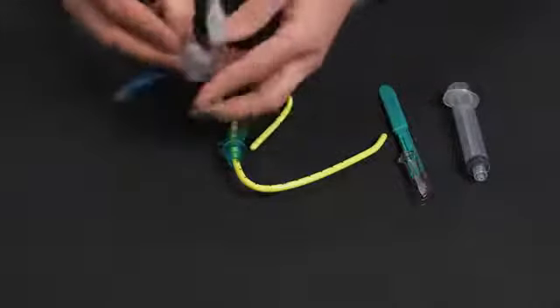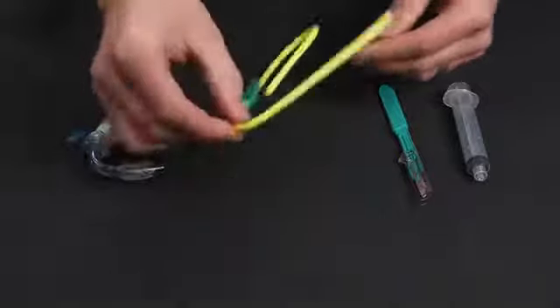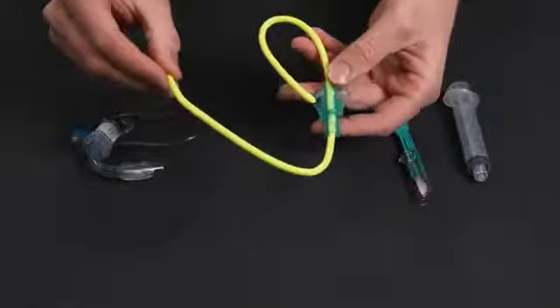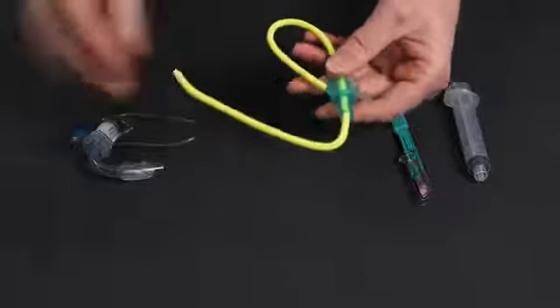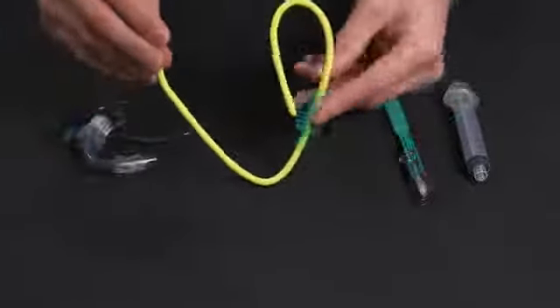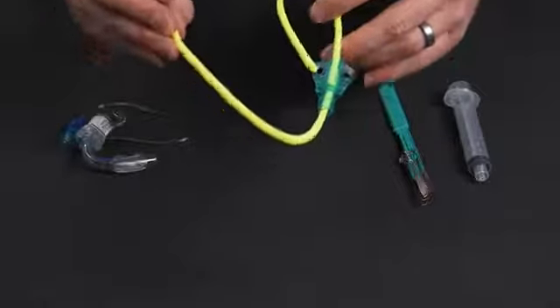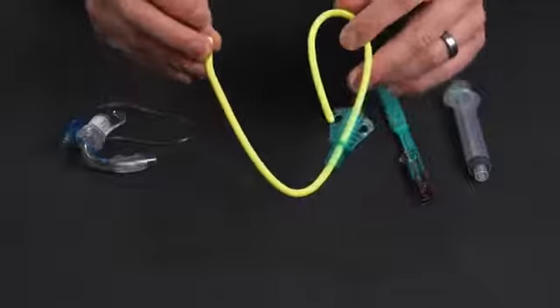Now, the second thing you're going to need is going to be some kind of introducer. Now, I like to use bougies. That's what this is. Now, this one is a specialized one that actually comes with this tube preloaded on it from North American Rescue. This just allows you to get this in place and secure the tube and not lose your spot.